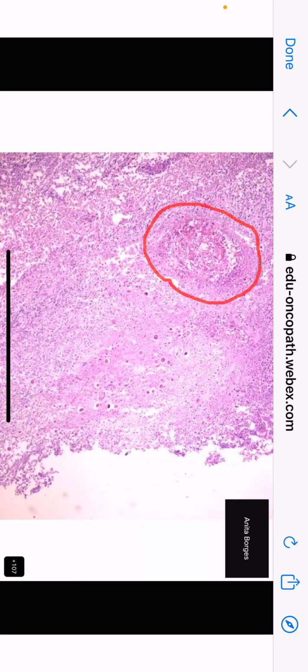That is thrombosed by this inflammation. And you can see that, and Limpy is right, these are trophozoites, and the trophozoites are actually entering into this vessel wall. So the trophozoites are inside the vessel wall. They have devitalized the vessel wall, you can see that, and there's thrombosis inside. So there is an inflammatory destruction of that vessel wall by this inflammation. And Limpy, you are right. These are trophozoites. Look at the trophozoites.